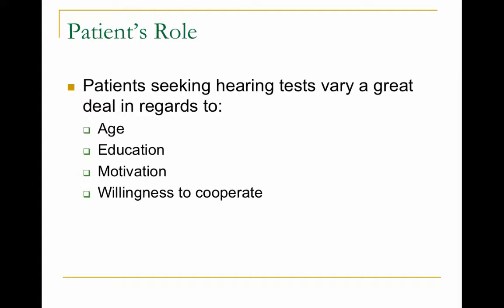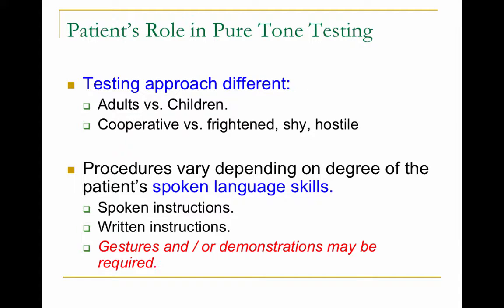The patient's role in testing. A patient seeking a hearing test could vary a great deal in regards to age, education, motivation, and willingness to cooperate, whether or not they want to be there. Therefore, your testing approach is going to be different whether you're working with adults or children, whether your patient is cooperative or frightened, shy, or even hostile: "I don't want to be here, my wife made me come." Procedures also vary depending on the degree of the patient's spoken language skills.